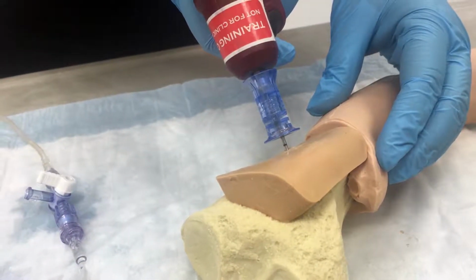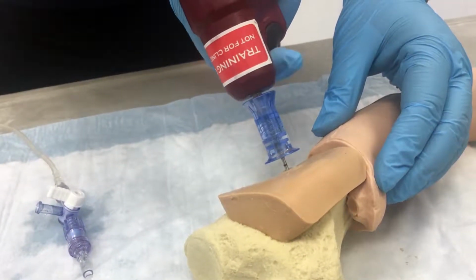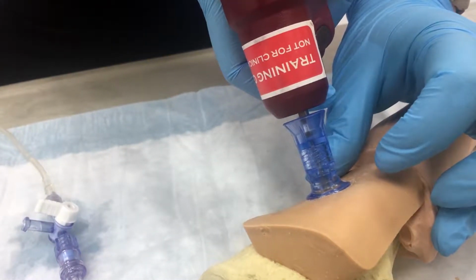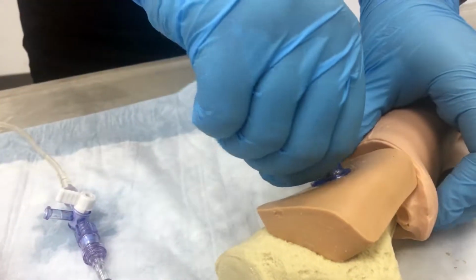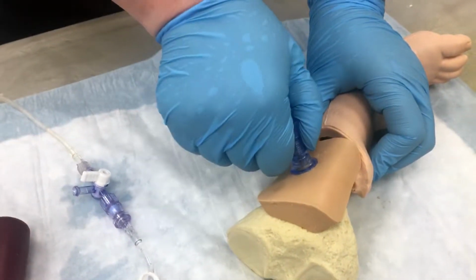When the needle contacts the bone, squeeze the trigger and apply moderate, steady pressure, allowing the needle set rotation to penetrate the bone. Note, if the driver should fail, disconnect the power driver, grasp the needle set hub by hand, and advance the IO into the medullary space using a twisting motion. Advance the needle set and release the trigger.